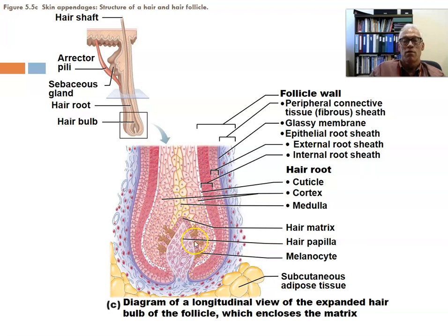And so these cells divide and produce all the cells that become the hair shaft, which eventually die just like in the stratum corneum, and produce yet another type of keratin that is a hard keratin, much like in the nail, but it's more flexible. And so all these cells are just keratinocytes packed with a particular keratin that's characteristic of hair. It's also very, very durable, and hence hair, when it falls from the body, can survive in the environment for a very, very long time.